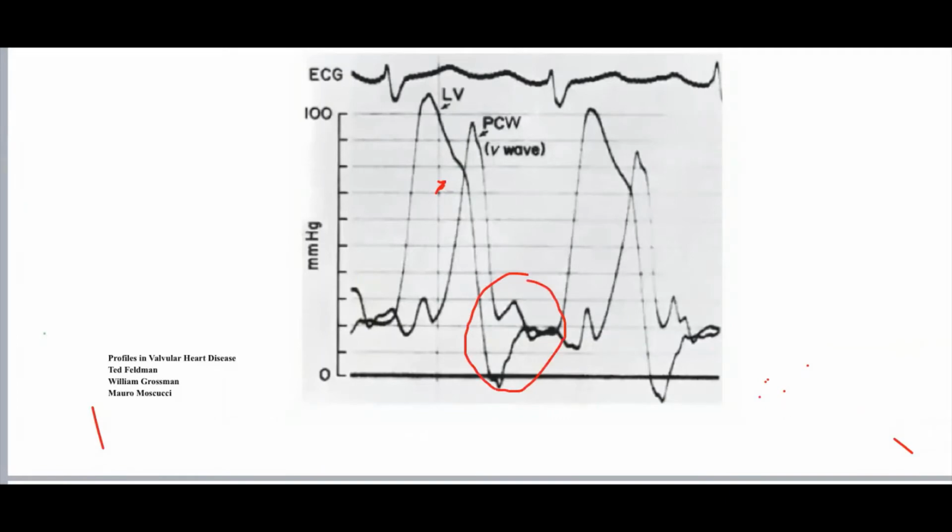This is a false gradient created by the time delay. So let's do it in our mind now. Shift the wedge back to where it should be. It should be here. If you shift it back to where it is, the gradient will go away. So we don't have a true gradient. It's just a visual illusion because of time delay. Here we just have severe MR leading to ventricularization of the V wave. Good. I'll skip this one.